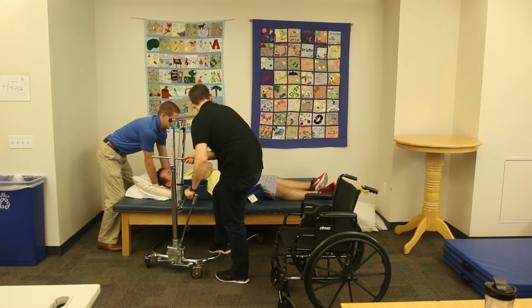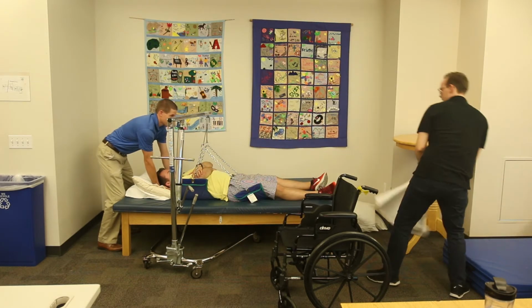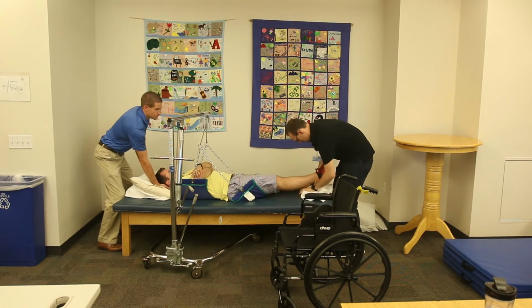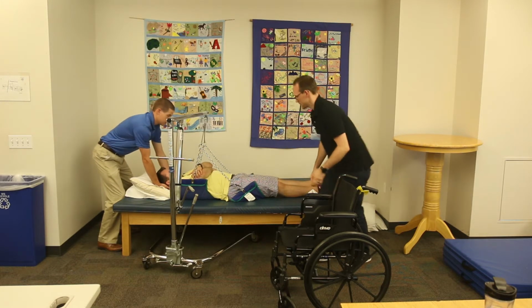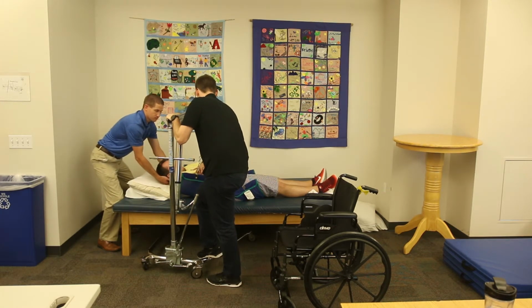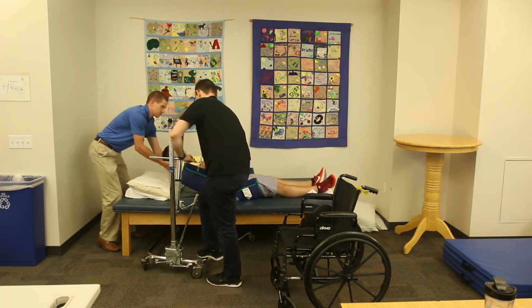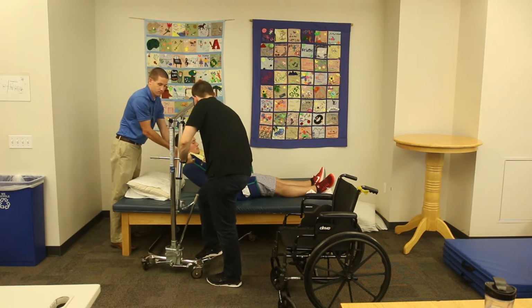All right, I'm gonna put a towel under your feet here before we get going. Everything's good. We just want to make sure that you're not getting sores on your feet while we're moving you. You feeling good? Yeah. All right, we're going to keep going up. And we're going to keep going up until your bottom's off the mat there.